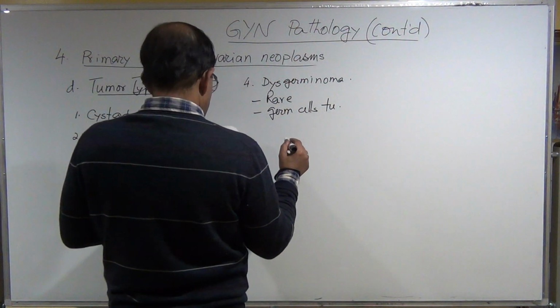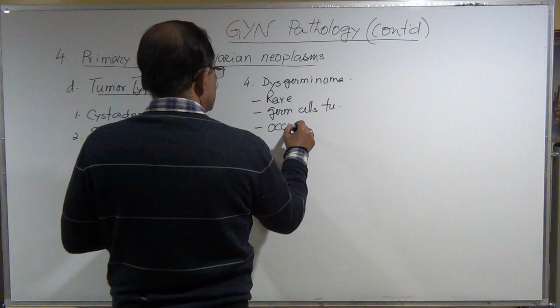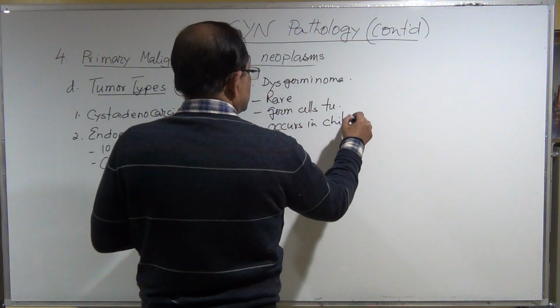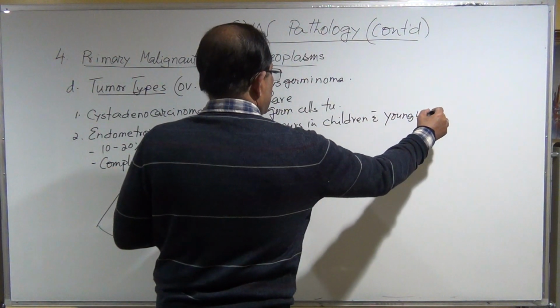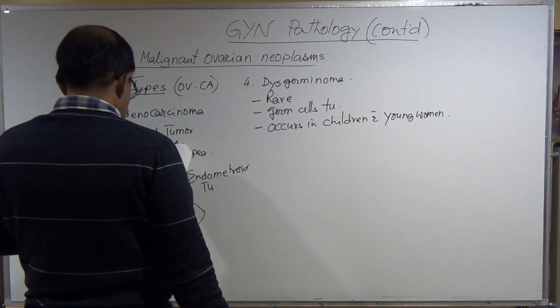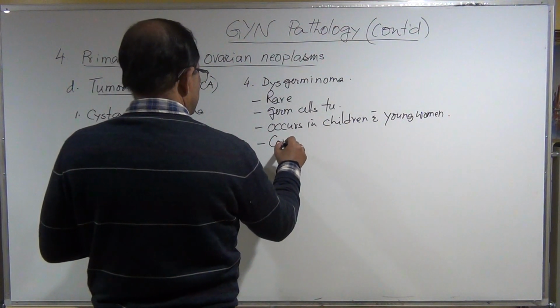It occurs in children and young women. And it is a complex solid mass.